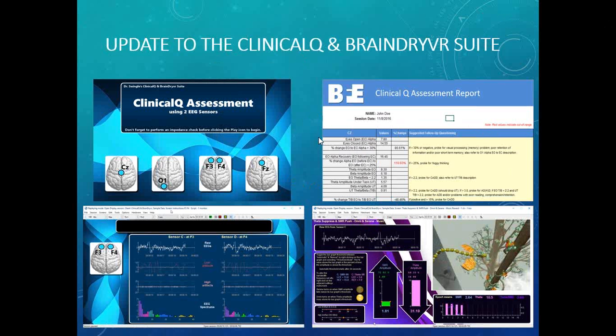Well, as Dr. Swingle would say, it's useful for any brain-based disorder or problem, and so it's obviously excellent at assessing the more popular conditions like ADD, ADHD, inattention, depression, or anxiety. It's definitely very, very useful for trauma release, PTSD, and things like that.